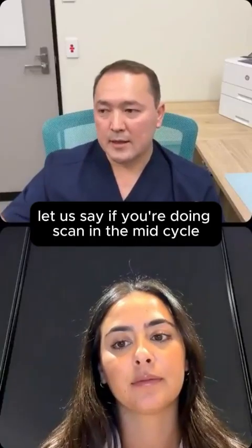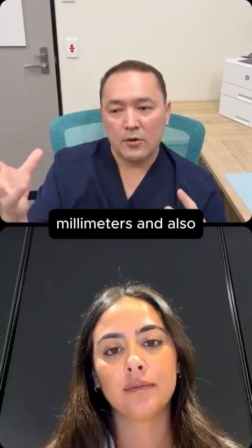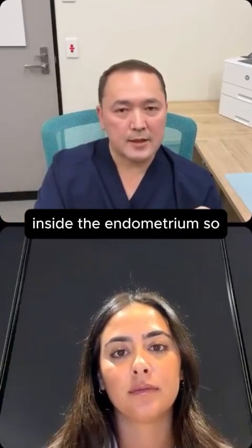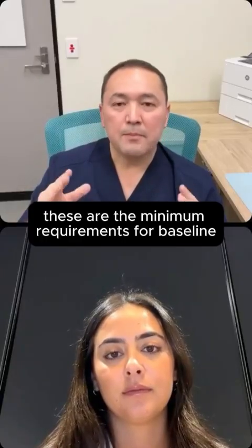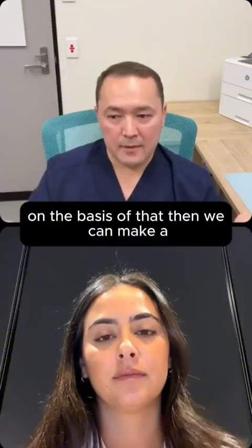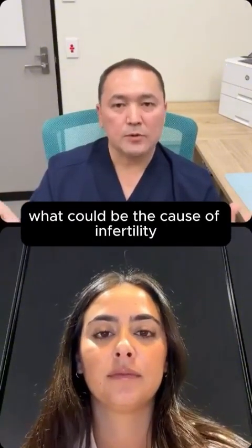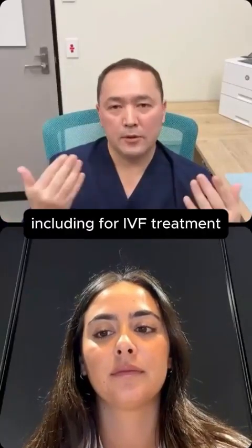Let us say if you're doing the scan in the mid-cycle, your endometrial thickness should be more than 7 millimeters. And also it should tell us whether there's any fluid inside the endometrium. So these are the minimum requirements for a baseline ultrasound scan. On the basis of that, we can try and understand what could be the cause of infertility and make a plan for fertility treatment, including for IVF treatment.